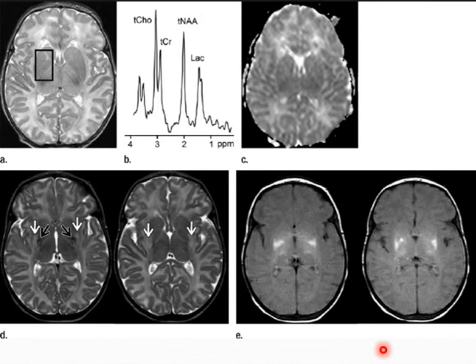For example, in this case, you can see the NAA, the lactate, choline, and creatinine from this voxel here. Okay. You can see the lactate is increased, indicating anaerobic metabolism in the basal ganglia. On follow-up images, you can see there is T2 abnormalities due to basal ganglia ischemia and infarction. Okay, so the appearance of a lactate peak indicates poorer prognosis. Okay, and the brain has gone into an anaerobic metabolism due to hypoxia that's strong enough to cause brain death, or part of the brain to be dead. Okay.